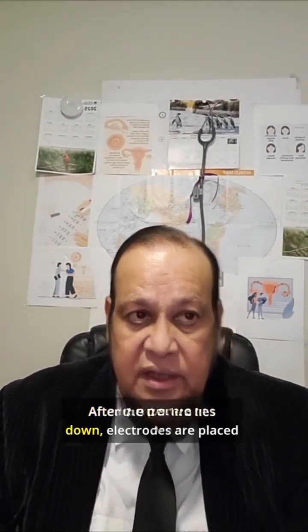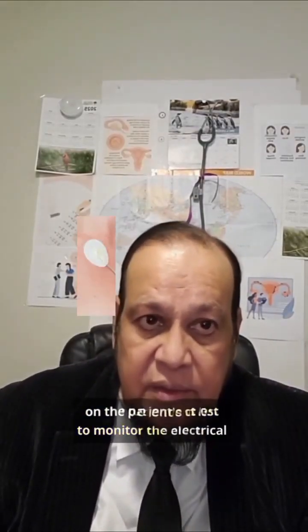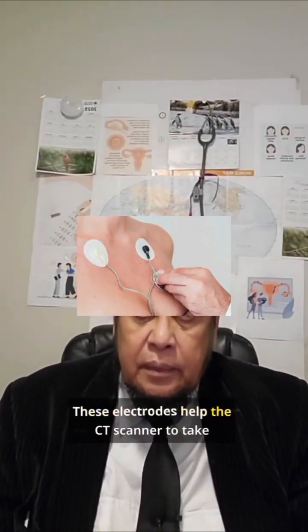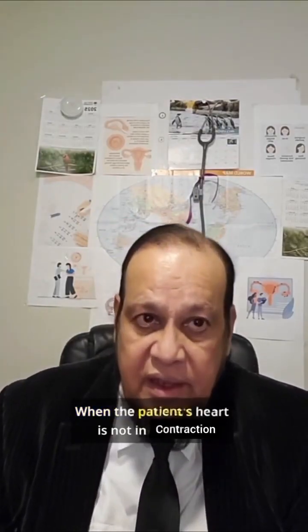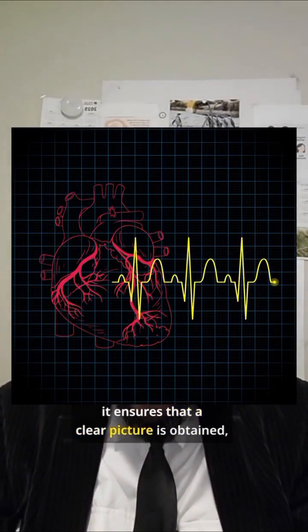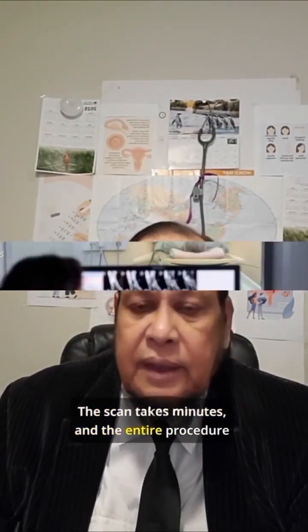After the patient is positioned, electrodes are attached to monitor the heart's electrical activity, that is, to keep an eye on the patient's ECG. It helps to take images, that is, photos or pictures of the patient, and ensures that the image is taken properly. X-rays are used for taking these pictures. The scan itself only takes a few minutes, and the entire procedure can take about 10 to 15 minutes.